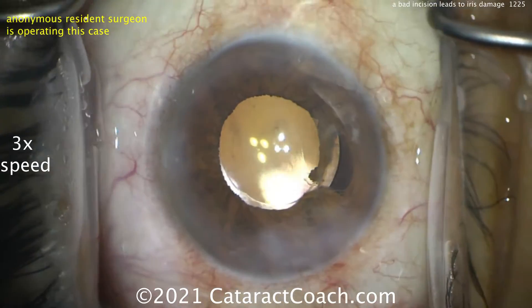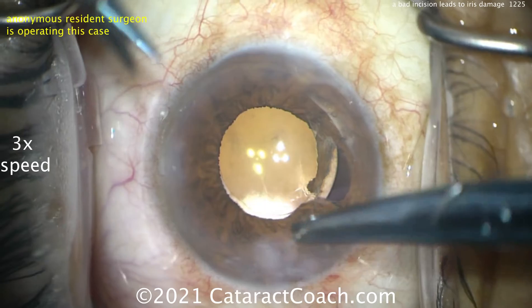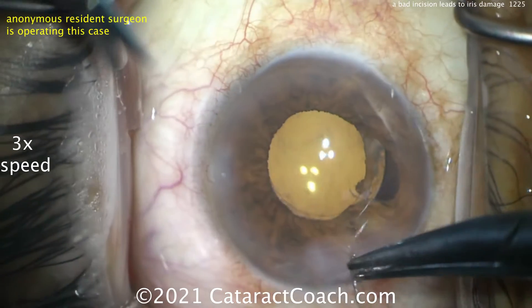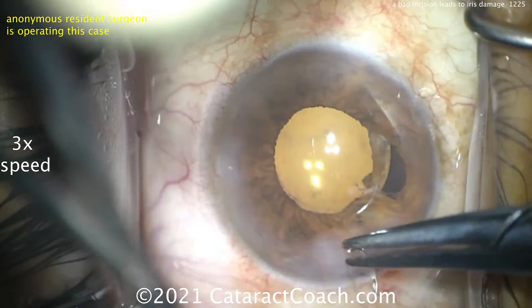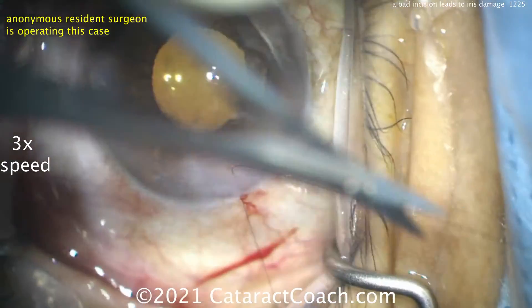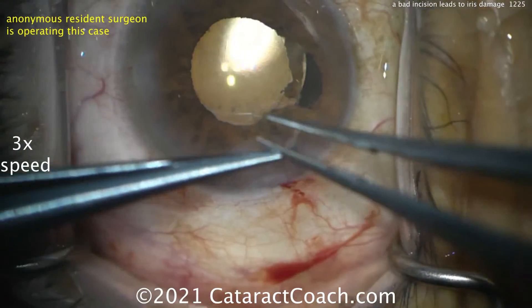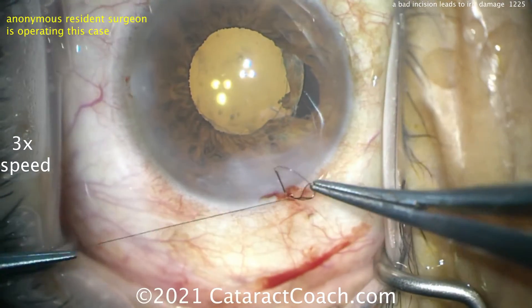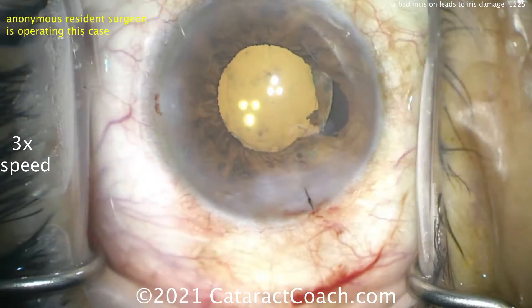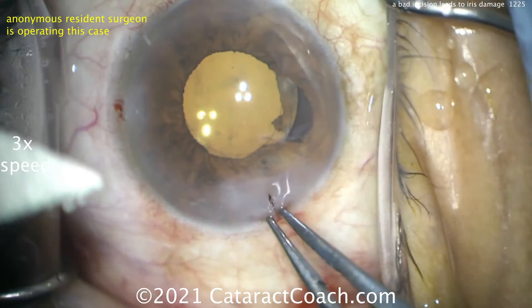This is a tough case and there's an important lesson to be learned: you really have to be careful making the incision — it sets up the remainder of the case. This patient now has a permanent iris defect, this corectopia, and that's of course iatrogenic. Remember, suturing is something you have to practice in the wet lab before coming to the operating room. It is a disservice to yourself if you have not done 500 sutures of 10-0 nylon prior to coming to the OR. You need to balance your social life and TV watching with putting in the effort to make yourself a better surgeon.